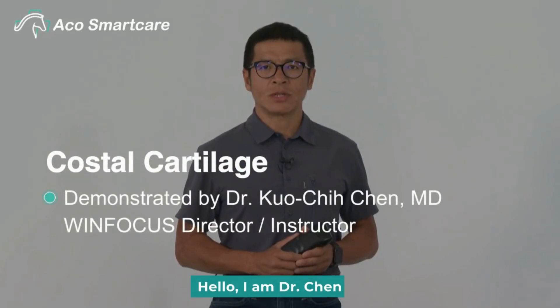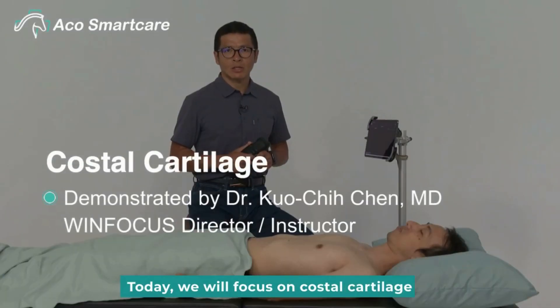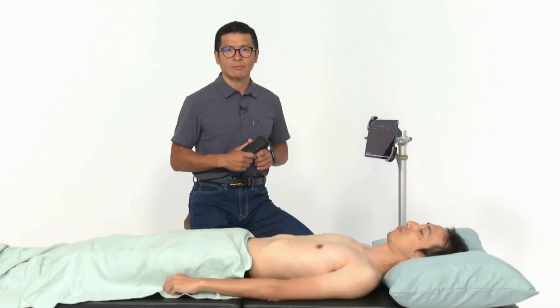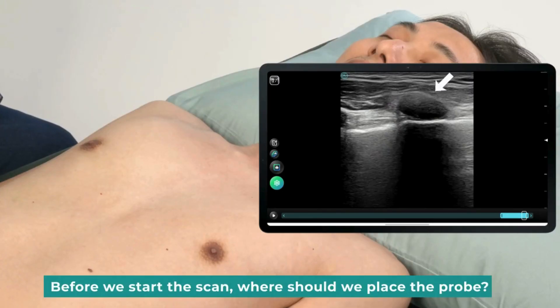Hello, I'm Dr. Chin. Today, we will focus on costal cartilage. We will go over scanning and positioning. Before we start the scan, where should we place the probe?